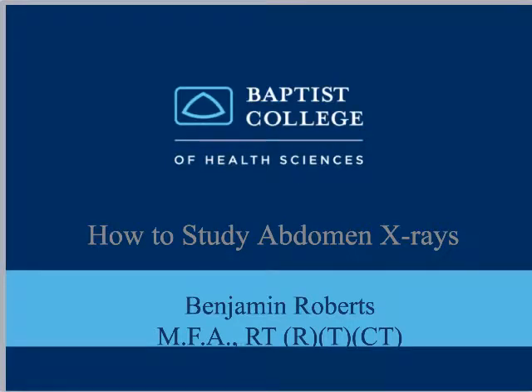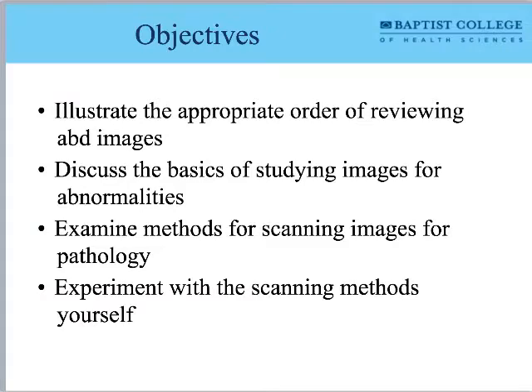Okay, I'd briefly like to address some tips and tricks for how to study abdomen x-rays that may be helpful to us as x-ray techs. So here's some of my objectives. I'd like to illustrate the appropriate order for reviewing abdomen images. I'm going to give us one model of looking at them. It may not be the only model, but it's a helpful one.